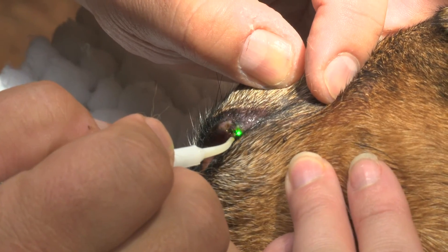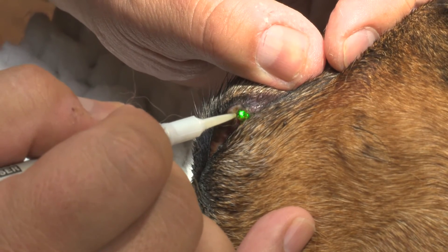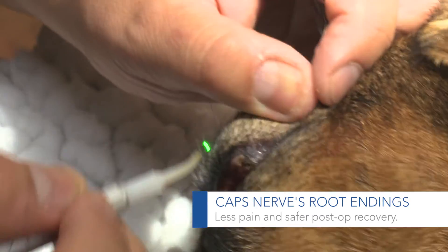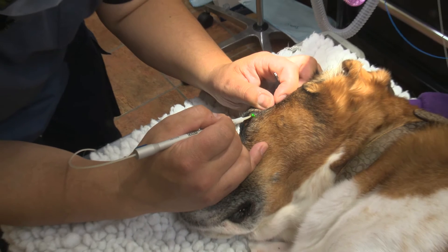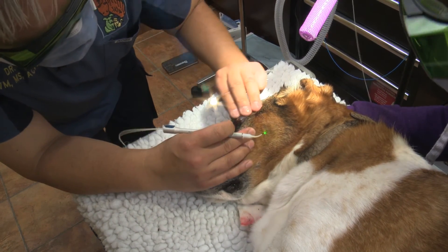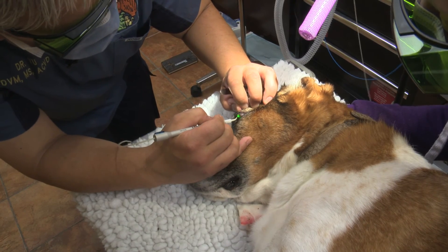This is typically a procedure that's done under general anesthesia. We have a more mature dog that we're a little bit concerned about using general anesthesia in. So the owner was grateful that we were able to remove it without actually having to anesthetize her pet.